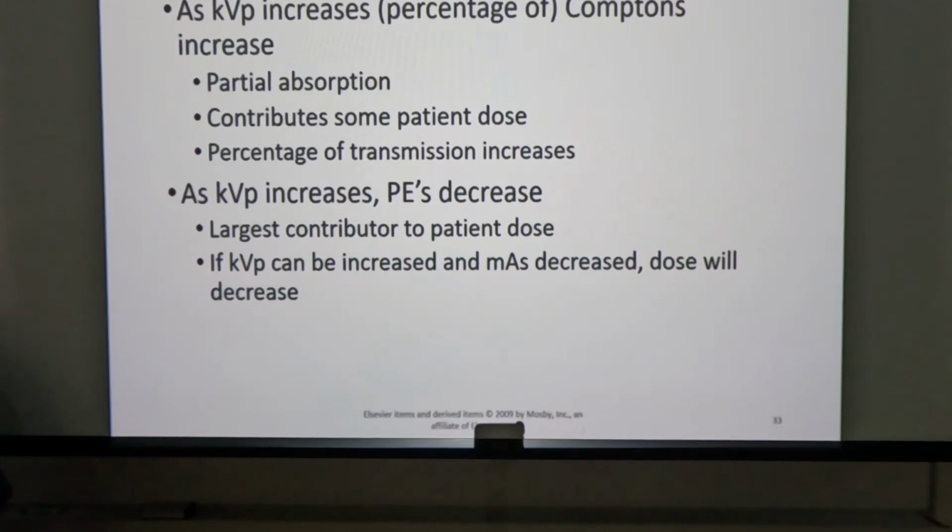So, you shoot a chest X-ray at, as if you could get this, 1 kVp. What are you going to have on the image? Nothing, right? Nothing's getting through the patient at that energy level. So it's total absorption. You shoot a chest X-ray at 120 kVp, you're going to get some penetration, you're going to get some exposure on the image receptor. Some of that exposure is going to be scatter radiation, partial absorption. Some is going to be straight penetration.